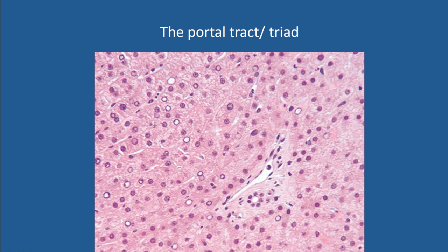Now, the bile duct, the smallest tributary of the bile duct, is made up of cholangiocytes. And these cholangiocytes are very uniform. They look exactly like one another. They sit very decently next to each other without getting into each other's way. And this is an appearance that has been called a rosary bead appearance by the religious, or pearls on a string by the fashionista. So this is a normal appearing portal tract or a portal triad.